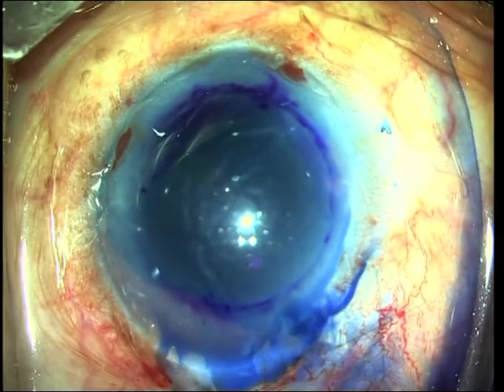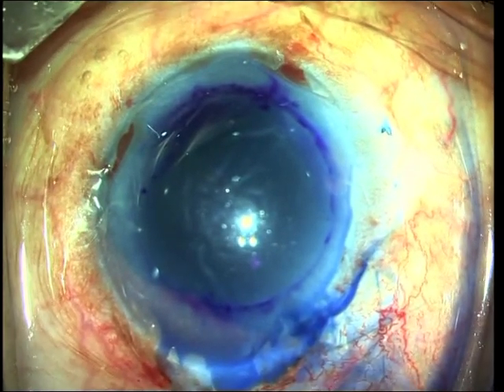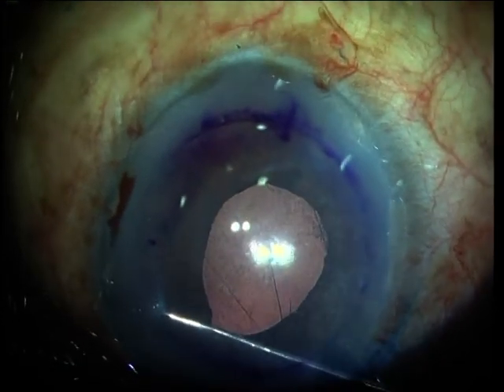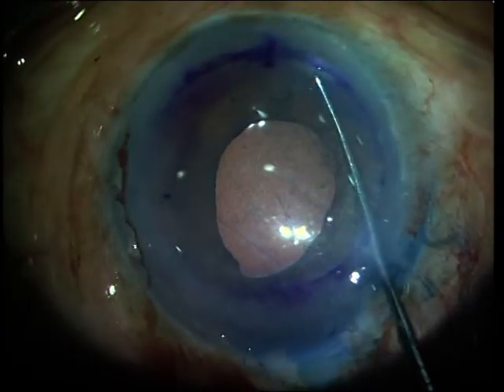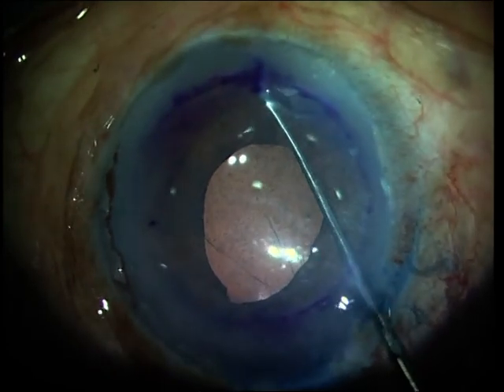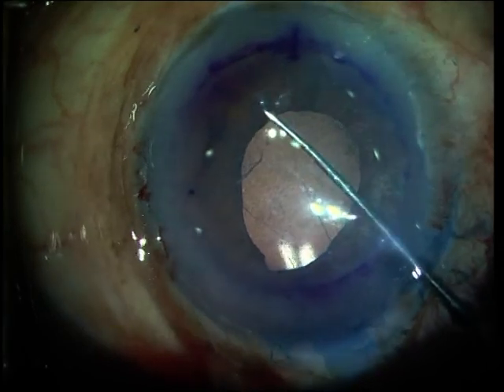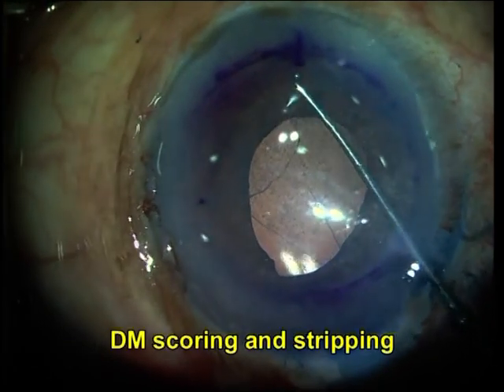Trypan blue is injected into the anterior chamber to stain the Descemet's membrane. Excess trypan blue is then washed from the anterior chamber. The blue-stained Descemet's membrane is then scored using a reverse Szynski hook.